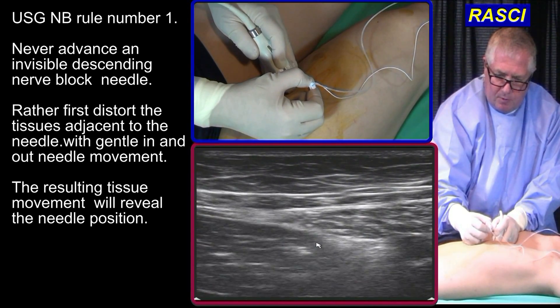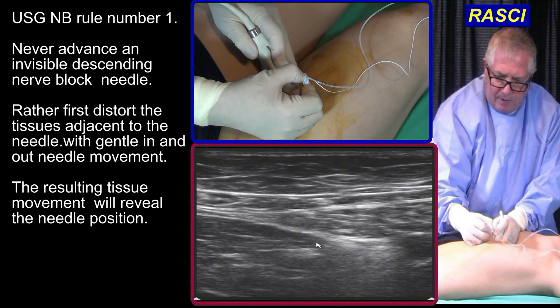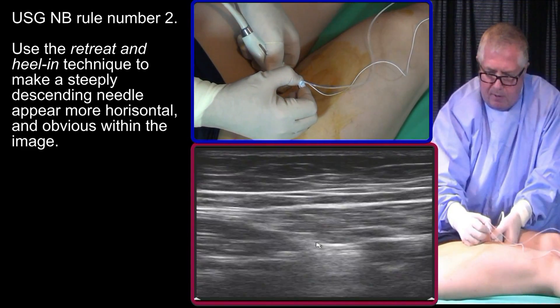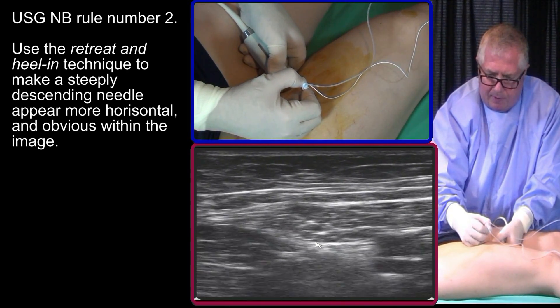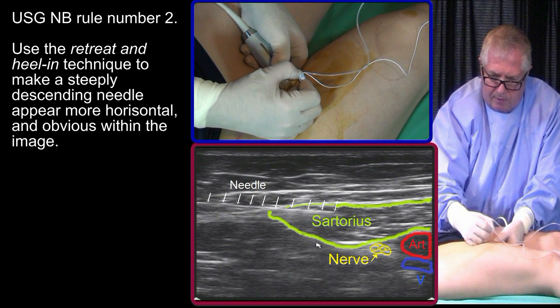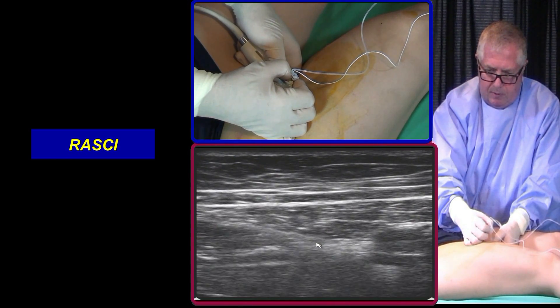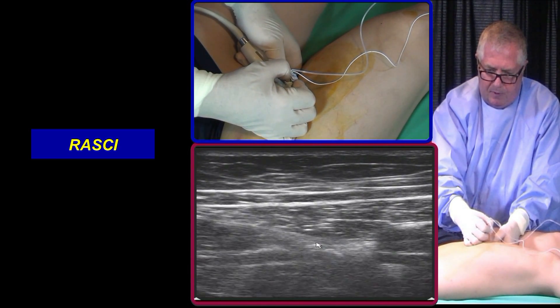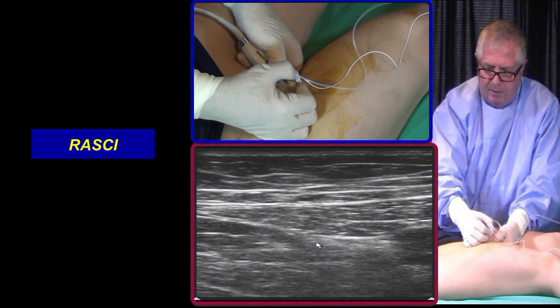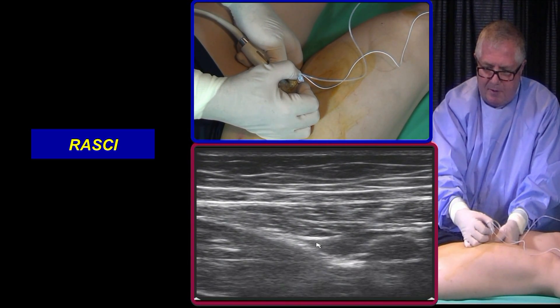You can see from the tissue distortion where my needle is. I'm going to penetrate the sartorius muscle. I'm through that covering fascia. I'm going to do a little bit of heel and retreat — just changing my grip on this transducer — this will make my needle appear more horizontal. I'm going to pop through this last fascia. Inject. See how it surrounds the artery.